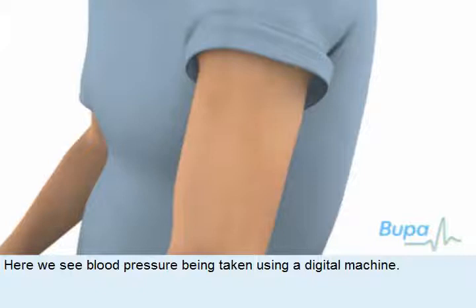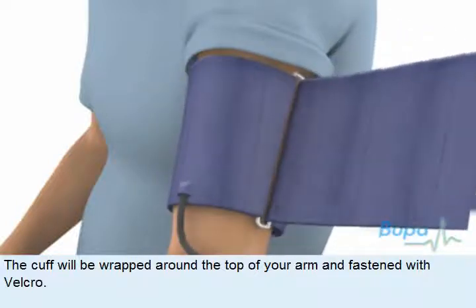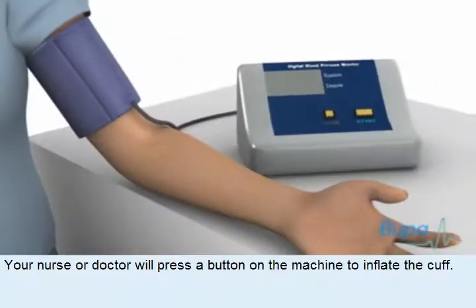Here we see blood pressure being taken using a digital machine. The cuff will be wrapped around the top of your arm and fastened with Velcro. Your nurse or doctor will press a button on the machine to inflate the cuff.